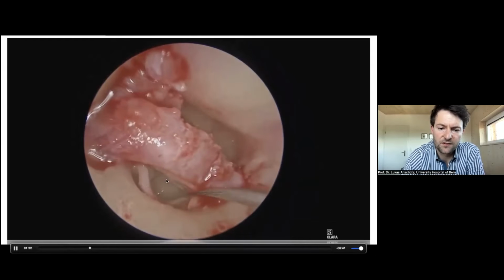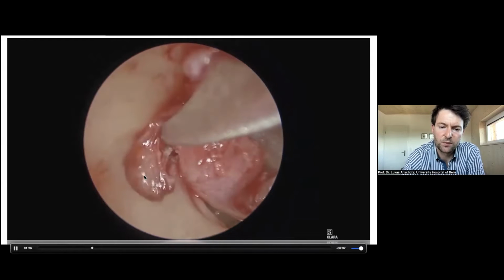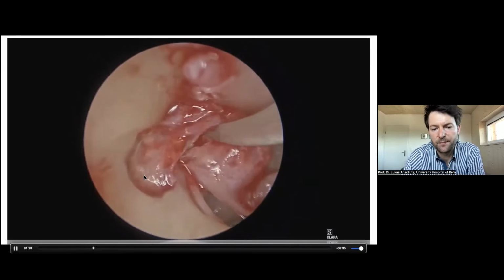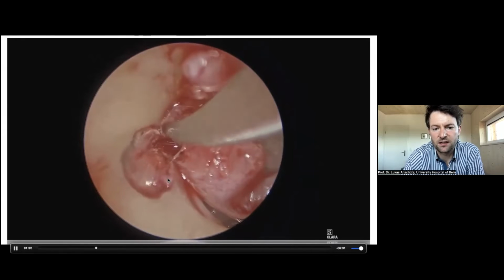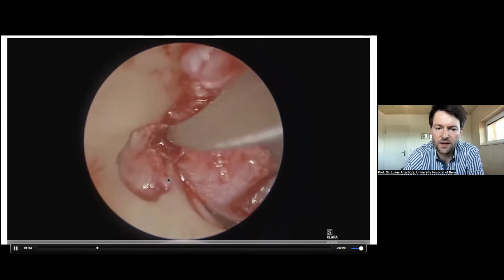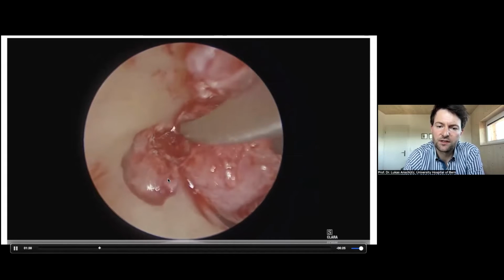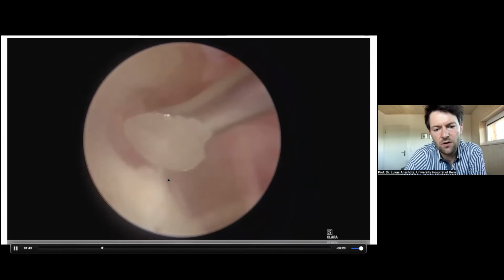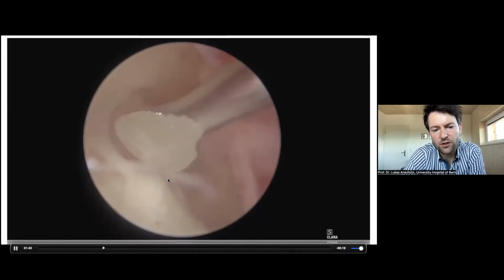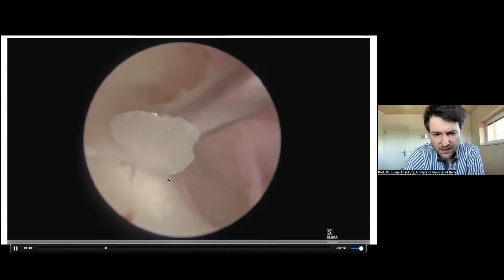Now we identify the annulus here, chorda tympani is here, and we can elevate the flap. We can enter the middle ear, and here the cholesteatoma is dissected away from the rest of the flap to be able to pull the flap anteriorly and inferiorly to get it out of the way for the further dissection. Now I start to remove a little bit of bone. It is important to remove the bone in a very gentle way.